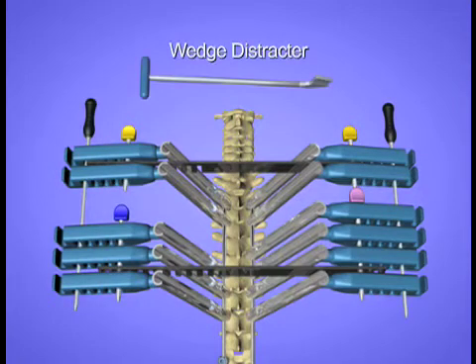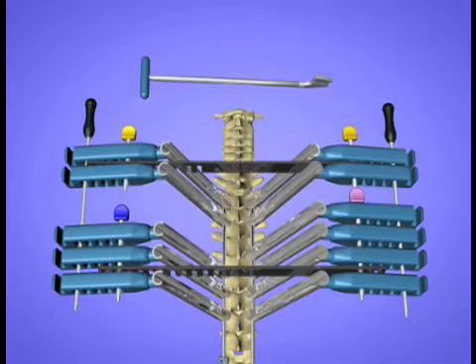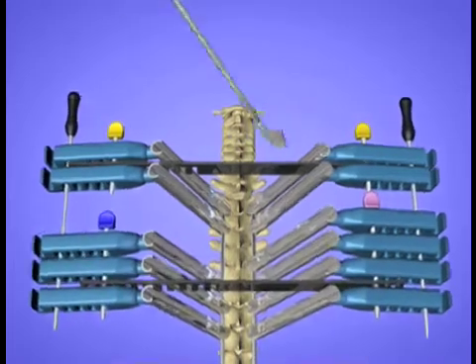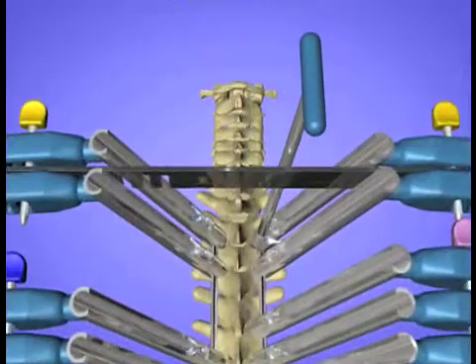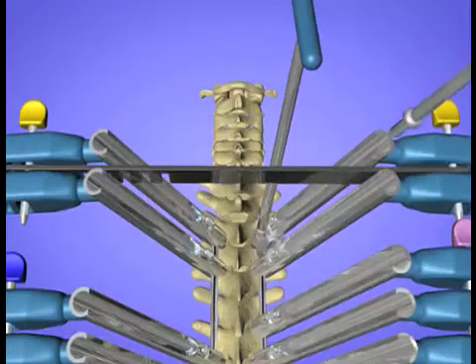In a tight space, for example, the concave side of the left upper thoracic curve, a wedge distractor can be used between the two right concave side derotators. The wedge distractor is inserted down to the rod and angulated longitudinally.